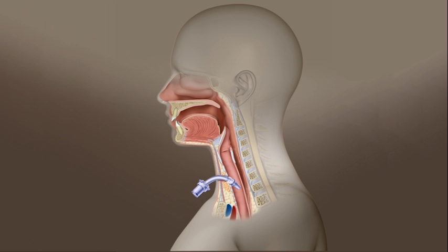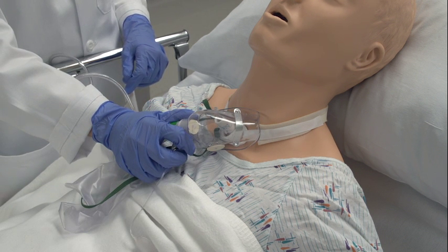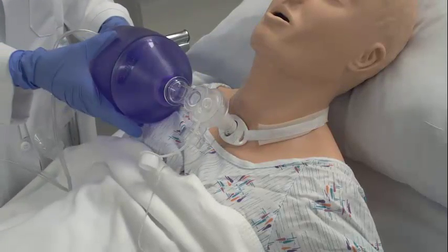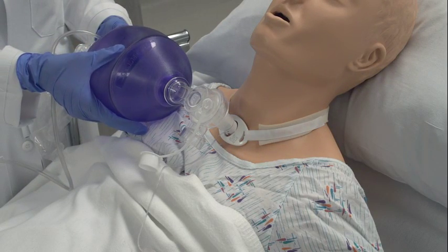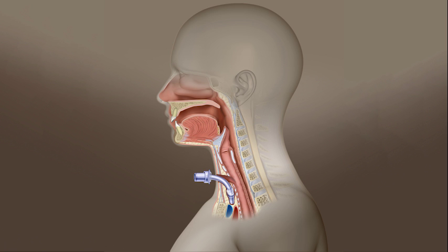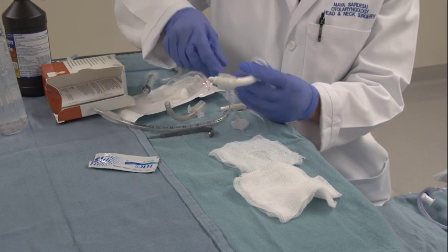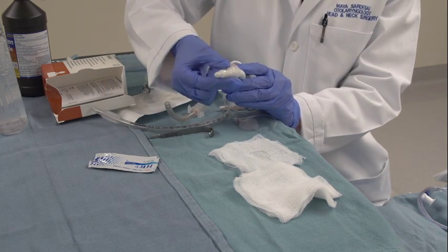If the native airway is not appropriate for bag mask ventilation, such as the case with a patient who has suffered severe facial trauma, you may place the mask over the stoma site and attempt to ventilate. If the tracheotomy tube is less than 7 days old, you should wait for the providers who placed the tube to reinsert the tracheotomy tube. This is because the tract has not fully formed and the risk of placing the trach in a false passage in the soft tissue is very high. Once oxygenation and ventilation have been assured, you should prepare to replace the tracheotomy tube.